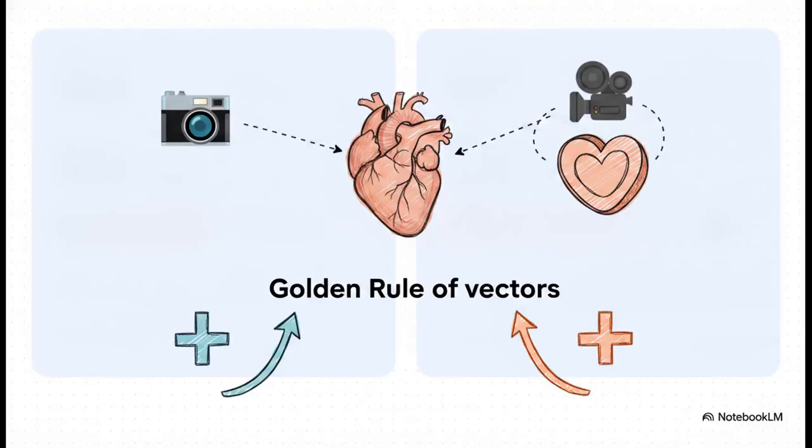If the waveforms are our alphabet, you can think of the leads as our perspective. Imagine you're directing a TV broadcast of a major sports game. You wouldn't just set up one camera, right? You'd place multiple cameras all around the stadium to catch every possible angle. That is exactly what a 12-lead ECG is doing.